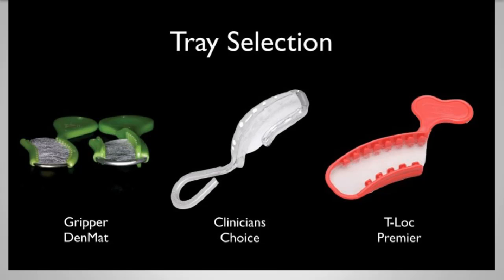Now I tend to use triple trays from first bicuspids to first molars for single units. I don't really like them for anterior teeth, any teeth that are in guidance, or implant components. Nor do I really use them for multiple unit cases. So for any multiple unit case, second molars, anteriors, or implants, I always use a full arch tray.